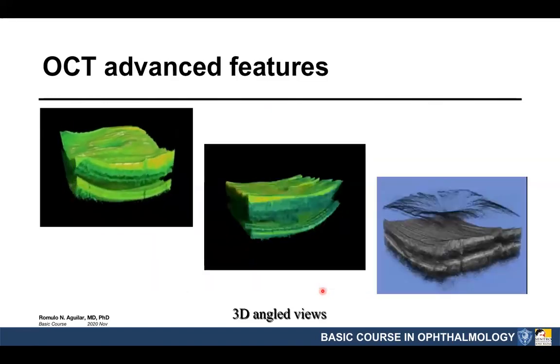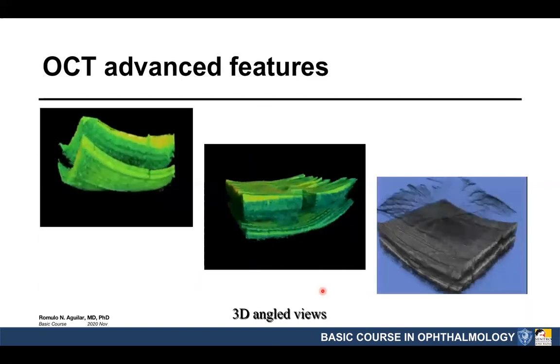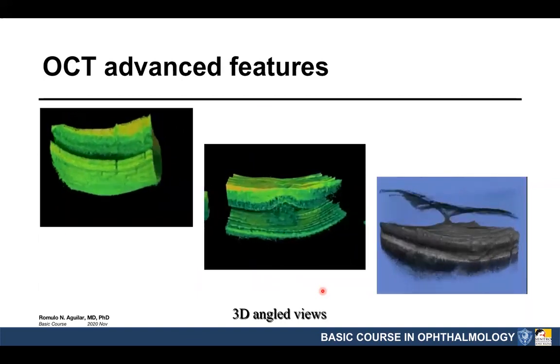Advanced features would be your three-dimensional capabilities of your OCT.